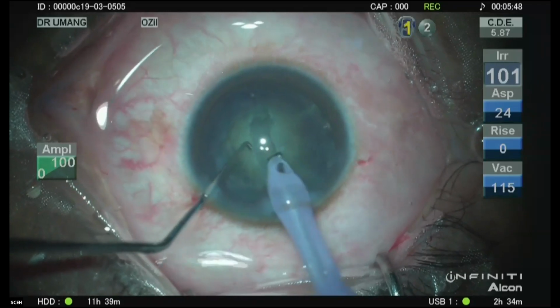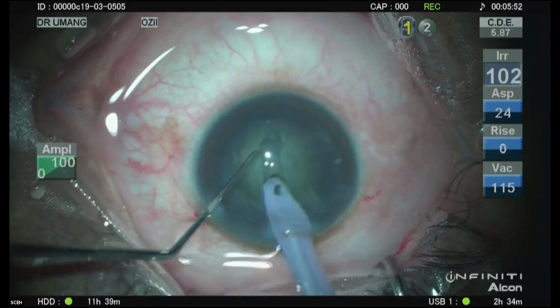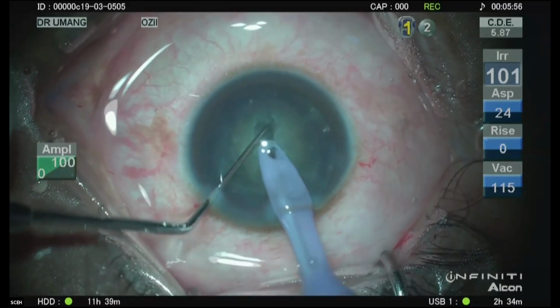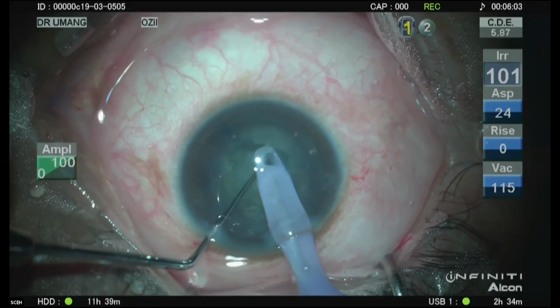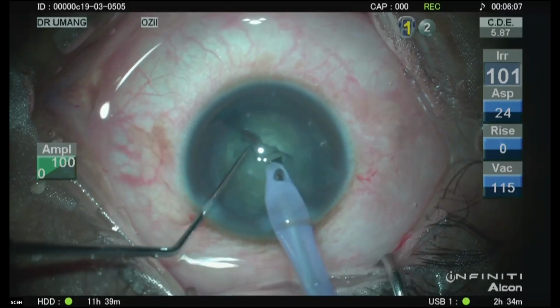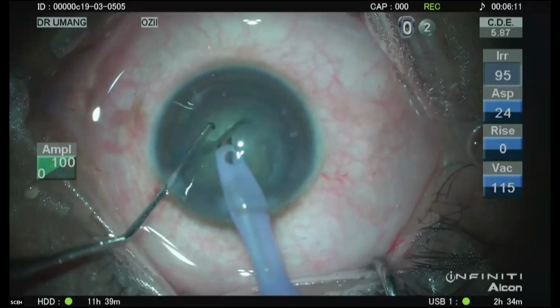So we've got a trench, and I don't know whether it was visible there. The posterior plate of this cataract was much denser than the superficial side. So we go right to the base and separate. And the posterior fibers require a little more power.